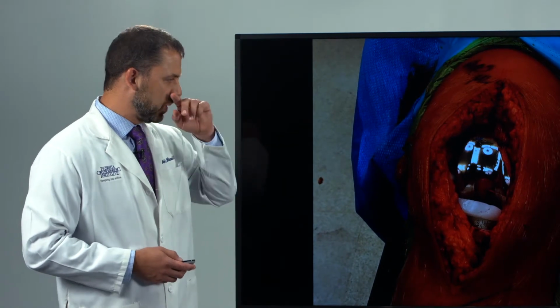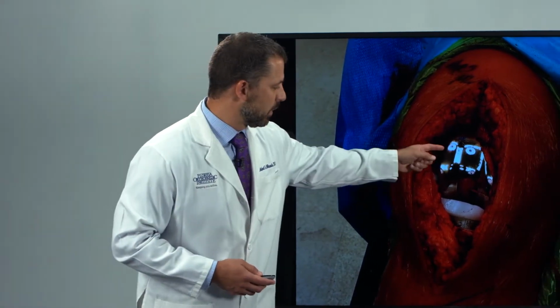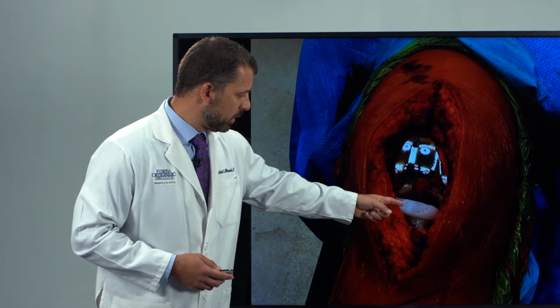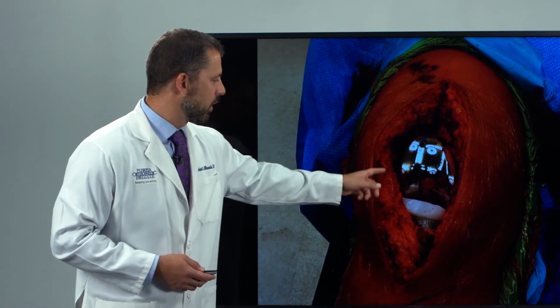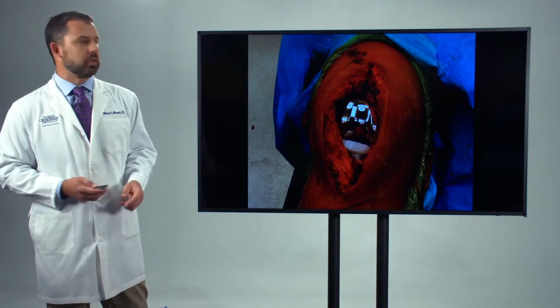And this is what the knee replacement looks like when completed. So here's the femoral component, the plastic on the bearing surface for the tibia, and then the tibial base plate. The kneecap is over here, and you can't really see the plastic on the knee replacement there.